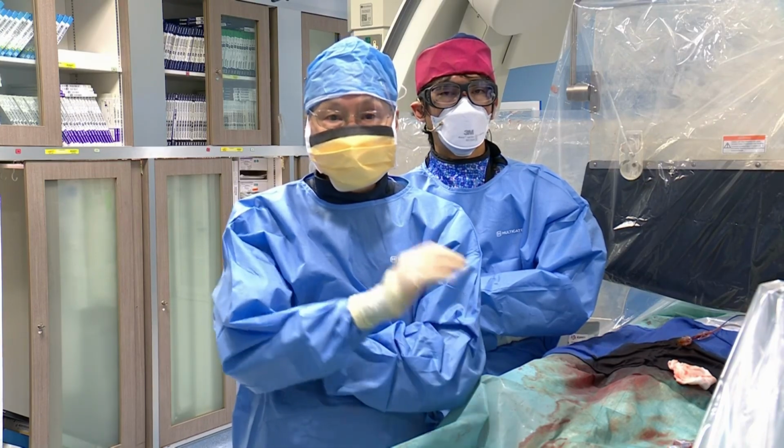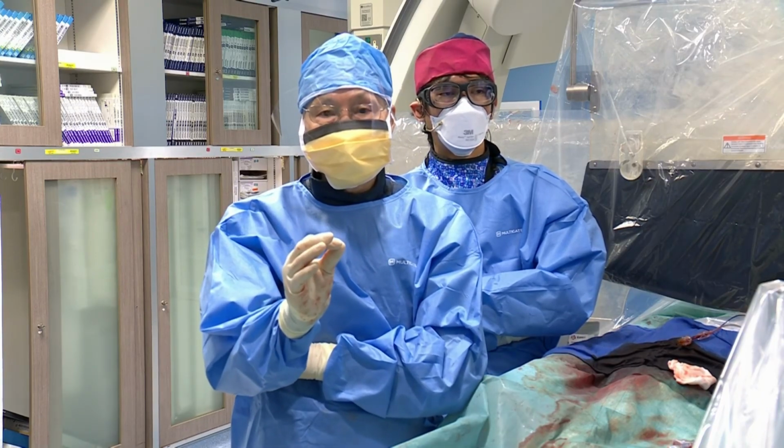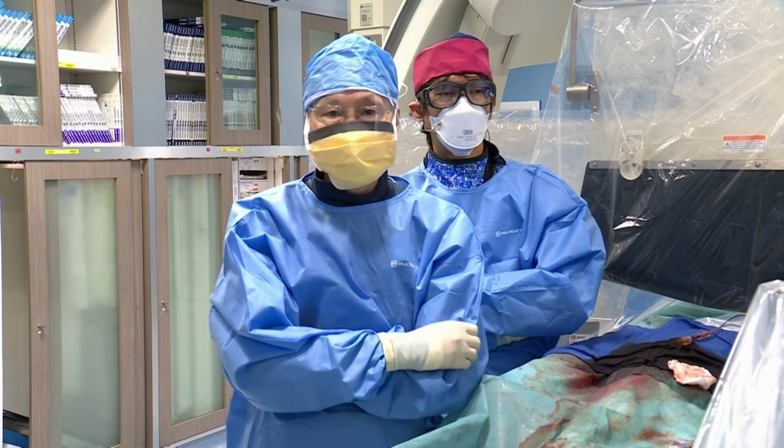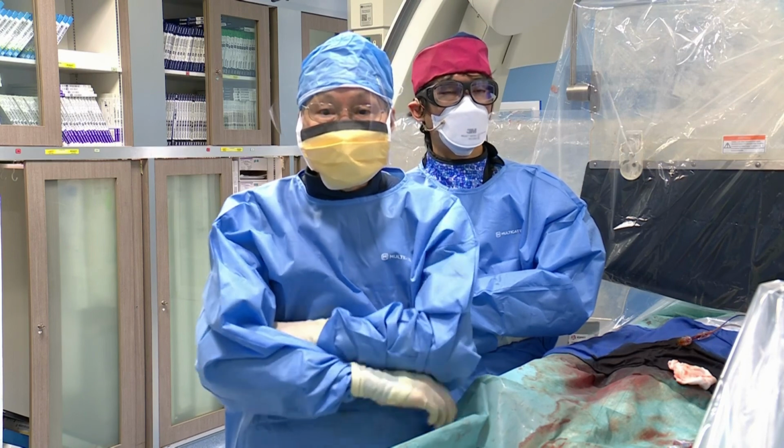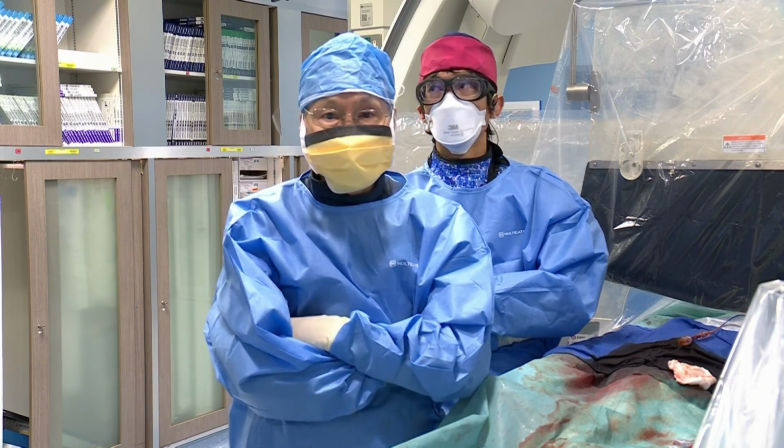And I think that the fine cross catheters don't image adequately. I've tried that; it doesn't work. So I think we are quite happy with the result.